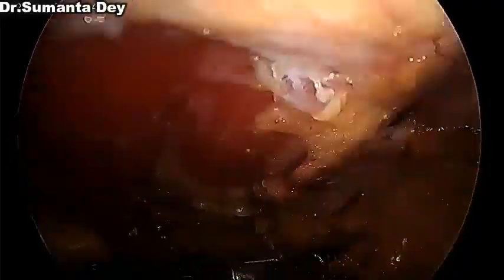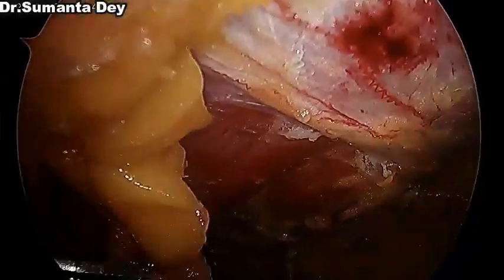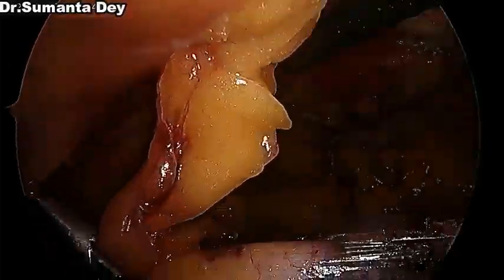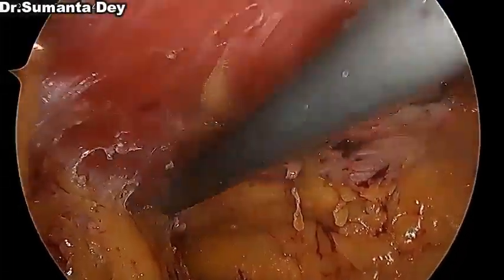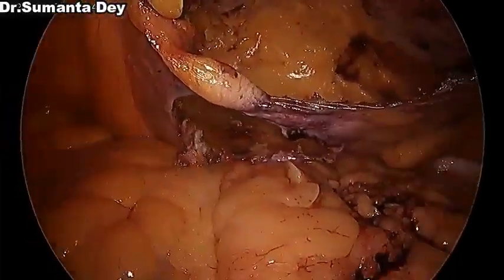So after a certain point of time, you have to continuously assess whether you have done enough dissection or not. You can see the arcuate line over there, and below that the rectus is bare, and you can see the inferior epigastric vessels at around 1 o'clock, 2 o'clock position.